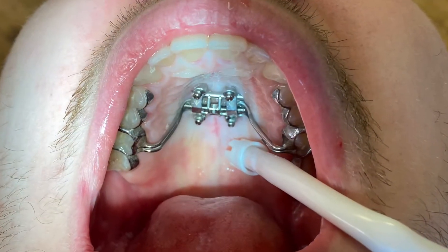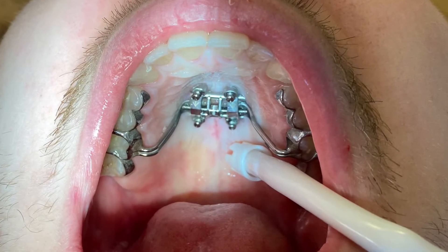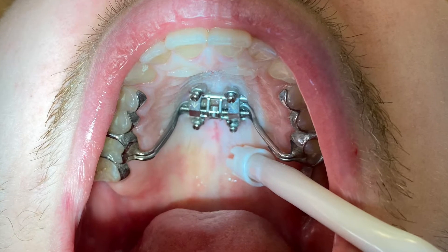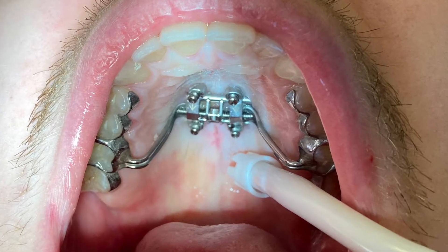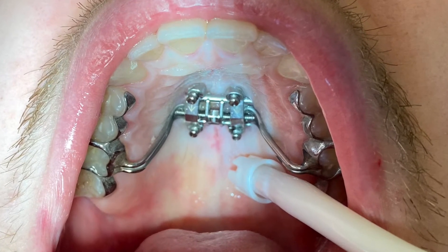In this photo, you can see that the initial posterior cuts have been made with virtually no bleeding.